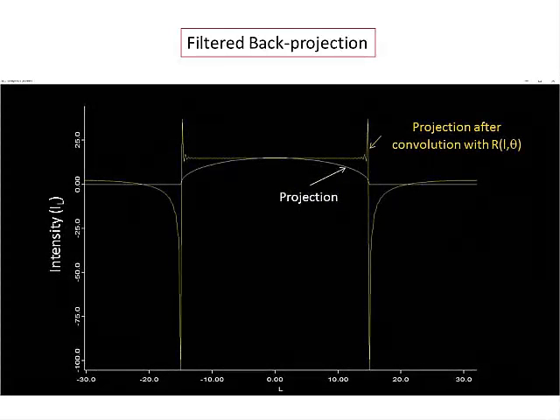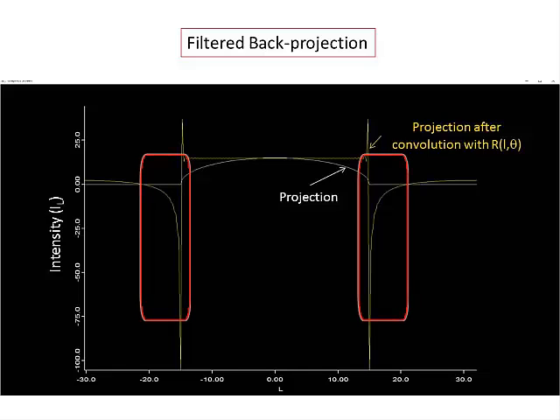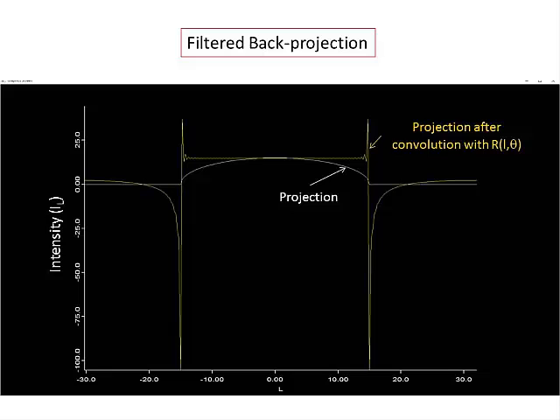This is the effect on the profile of the circular object that was reconstructed by back projection earlier. The regions outside the confines of the object are now negative, where in the unfiltered back projection the image was positive. Also, the region from within the object itself now has a flat profile and does not have the maximum seen in the projection. We can now do the same process of back projection as before, except using the filtered projections.